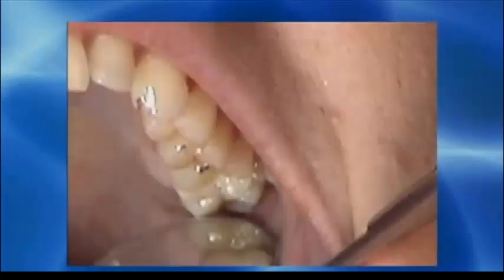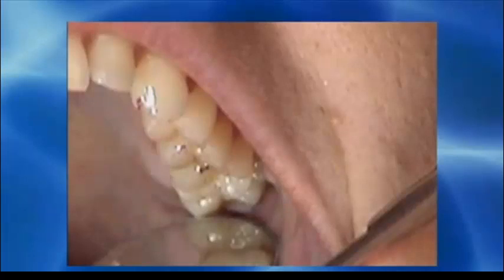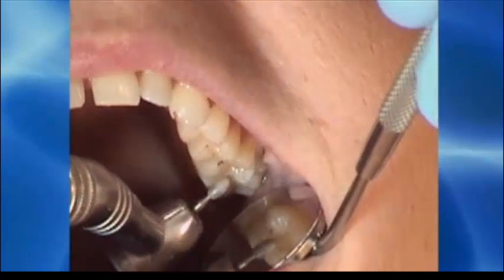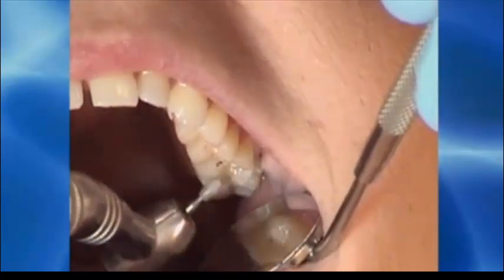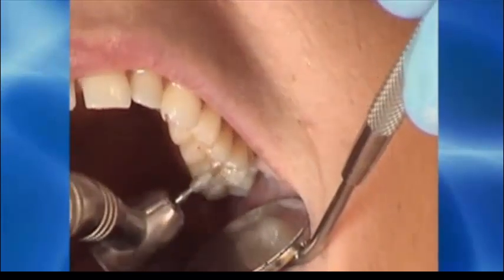Here on the mesiopalatal aspect of the upper first molar on the left side, you can see some of the long disclusion present with the linear marking that's emanating from the slope up to the cusp tip. Now I'm going to adjust that area. You can see I've taken the burr and lightly I'm dusting the cuspal incline, removing that mark in its entirety as that's a balancing interference.